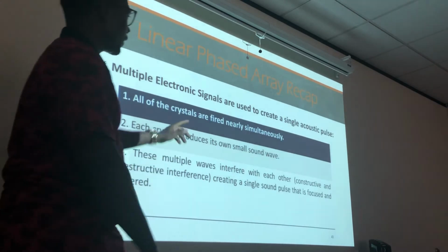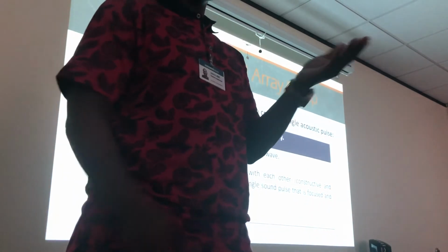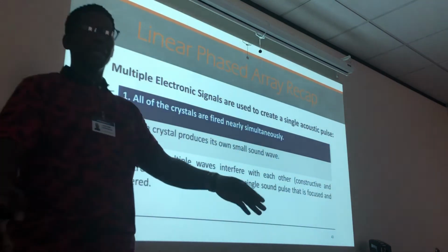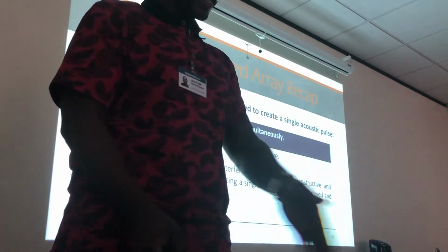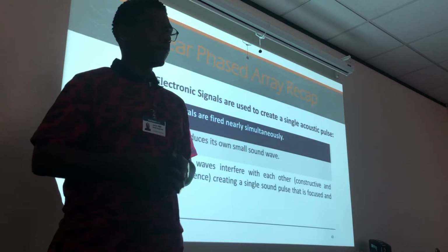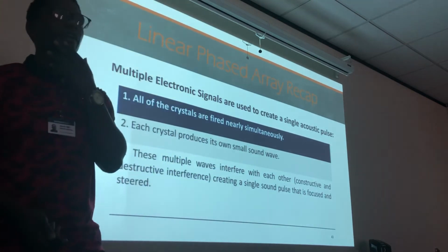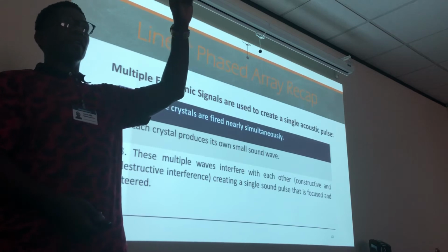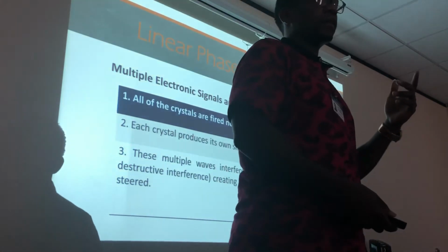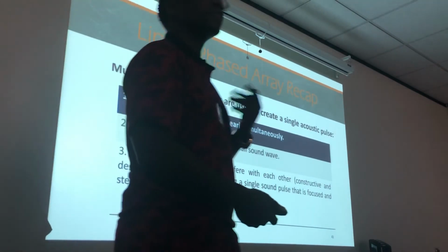The thing that makes a linear phased array unique is that even though the transducer face or the scan head is flat, it's still creating a sector image. That's what makes it different from a regular linear transducer, right? It's the image shape it's creating, because of how the beam fans out, like a windshield wiper blade or bicycle spoke, radiating out of each scan line. How is it steered? Electronically. Electronic steering. How's the focusing? Electronic focusing. What kind of image shape again? Fan, sector. Sector image shape.